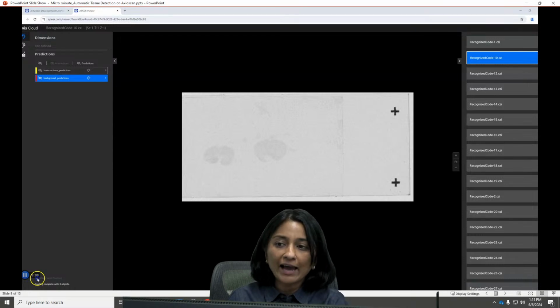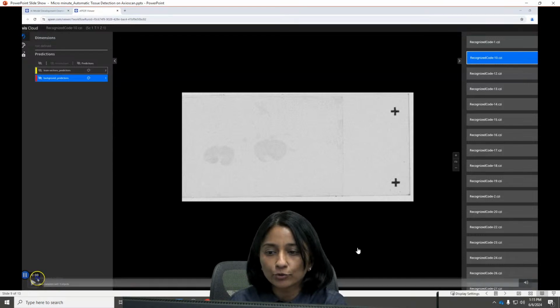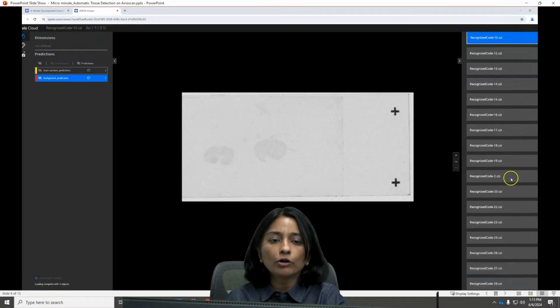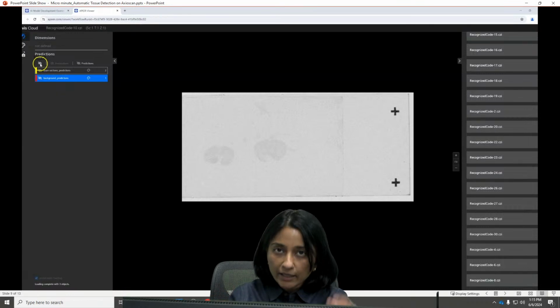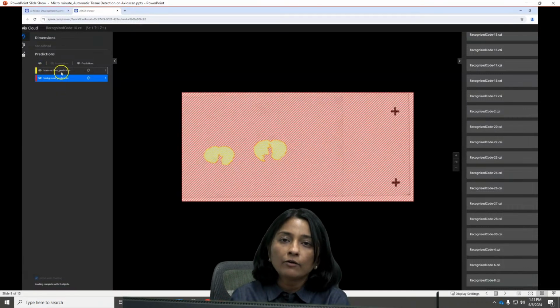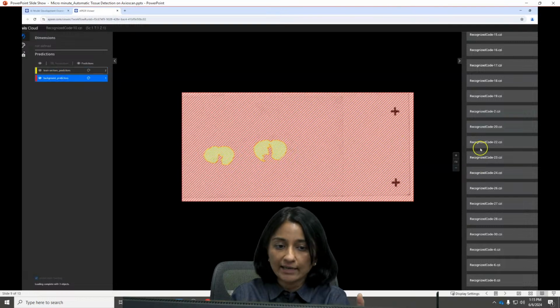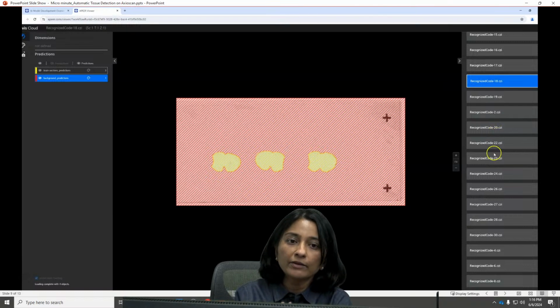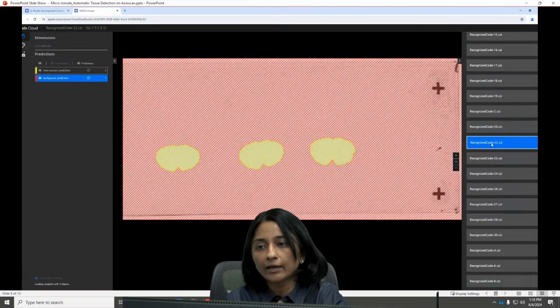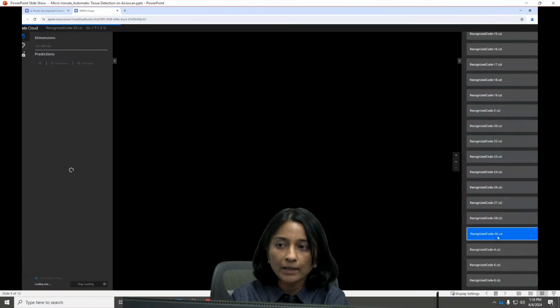But now that we have access to AI and all of the image analysis settings that you can create, basically all you do is collect as many preview images as you can from each of your slides. So if you have 50 slides like I had in this particular example, I collected all the preview scans and I fed them into our ZEISS cloud platform.